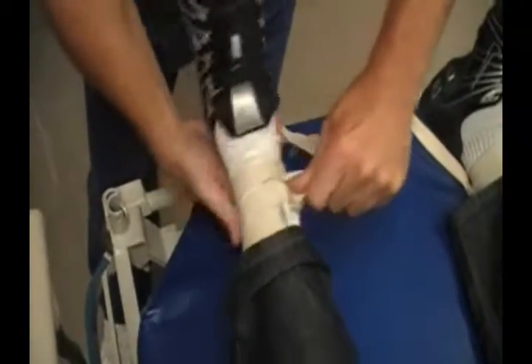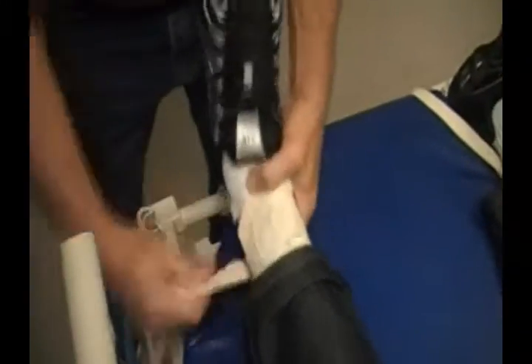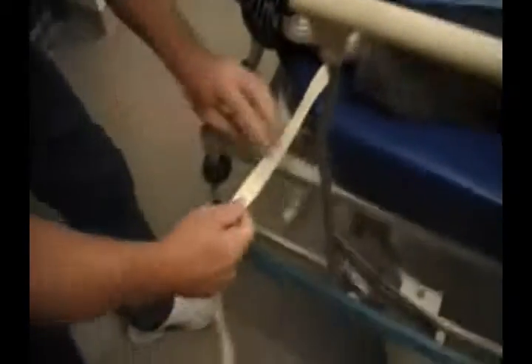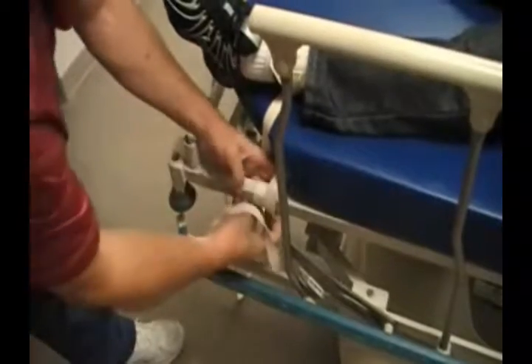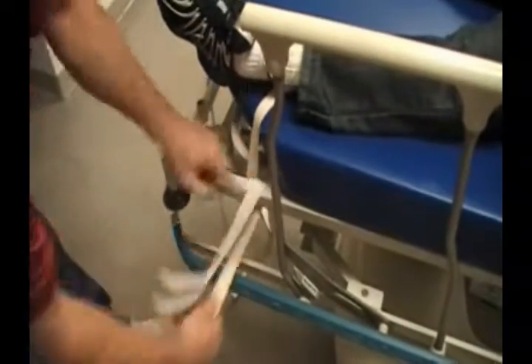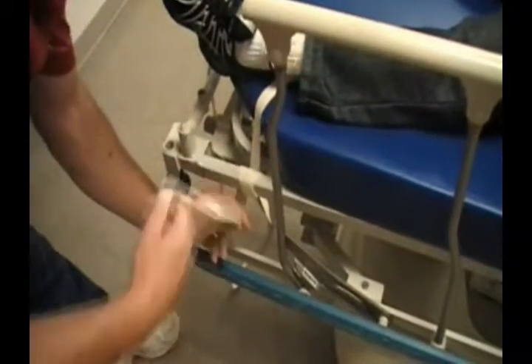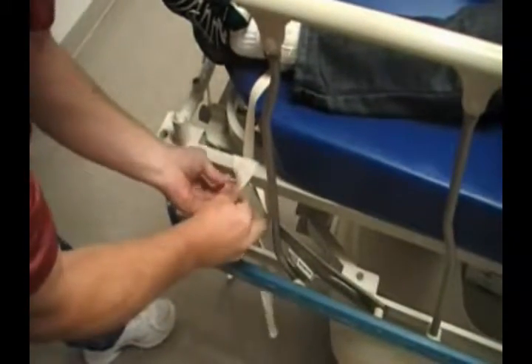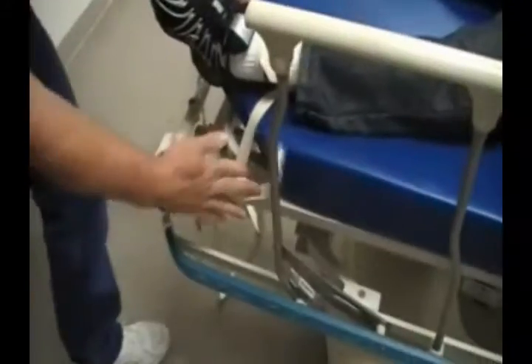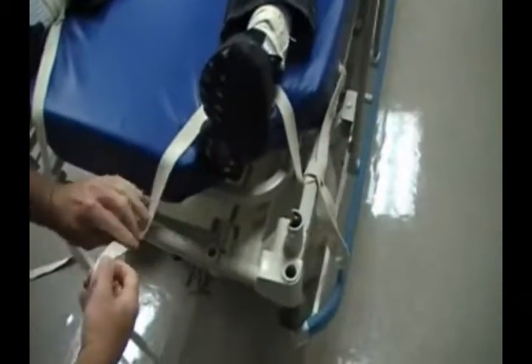Turn the restraint down so it's at the bottom. Now you have your straps. Tie one to each side. Go down between the bar, going on each side of the strap to create a V. Put your fingers there, hand it through, and pull it tight — that side is now tied. Coming over to the other side, you can do the same thing or use a slight modification.